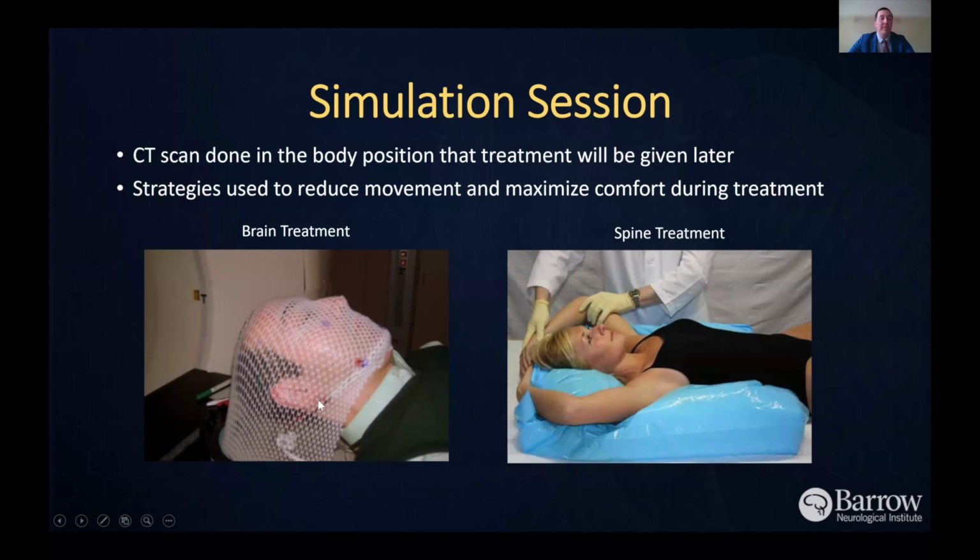And so on the left would be, for a patient with acromegaly undergoing a radiation treatment, we'd make a mask similar to this, mostly several days before the actual treatments.